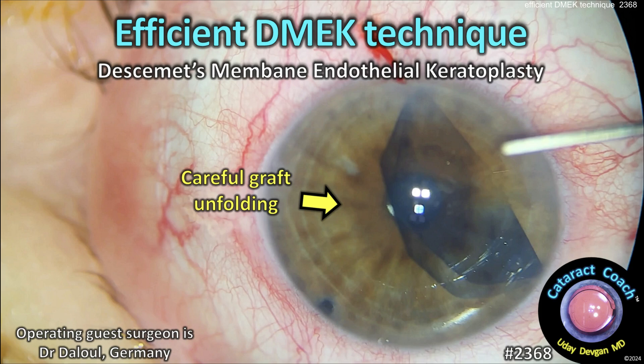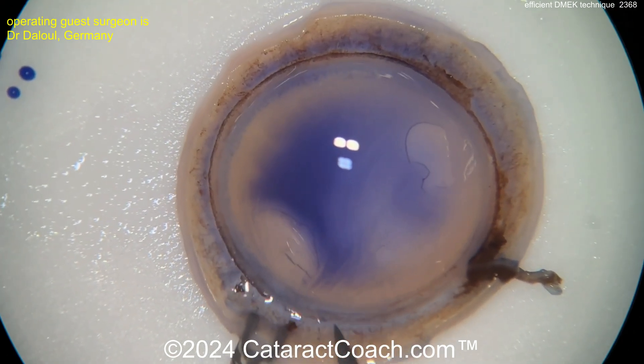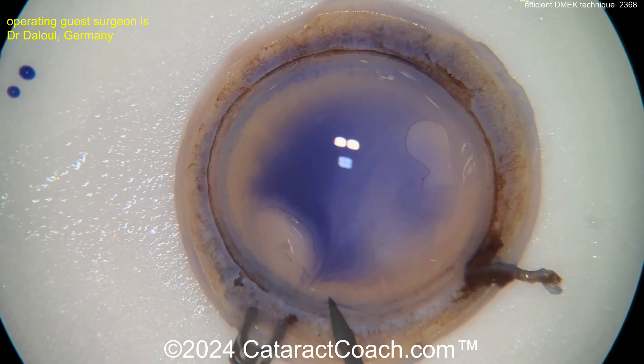Welcome to CataractCoach.com. Today we're covering efficient DMEK technique — that's Descemet Membrane Endothelial Keratoplasty. This is a nice technique to transplant just the inner layer of the cornea. Here you can see the entire donor cornea, which has been prepared a little bit in advance.